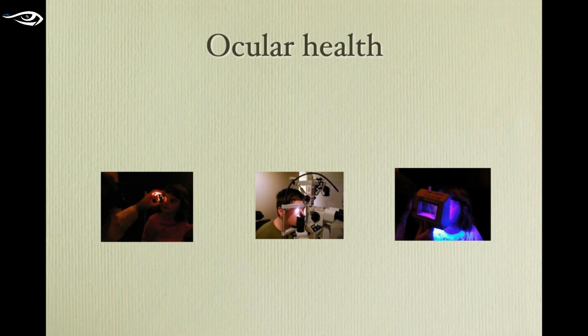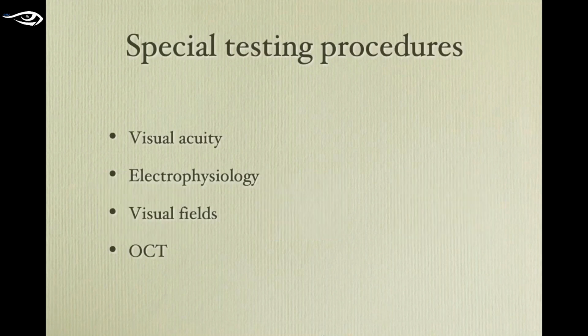Use a slit lamp if you can. There are handheld slit lamps. You can use an ophthalmoscope and a handheld lens. There's a variety of techniques for looking at the anterior segment. I use a direct ophthalmoscope as much as I can. High power, +6, +8, +10. Bright source, get magnification. Very useful and underappreciated.